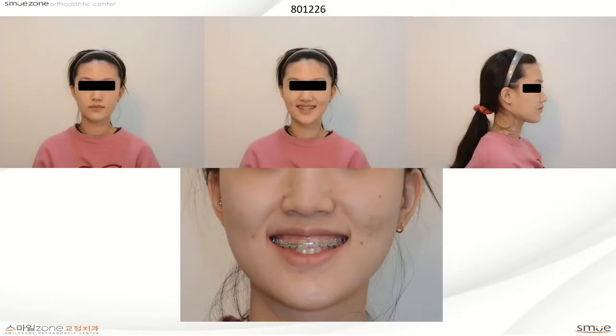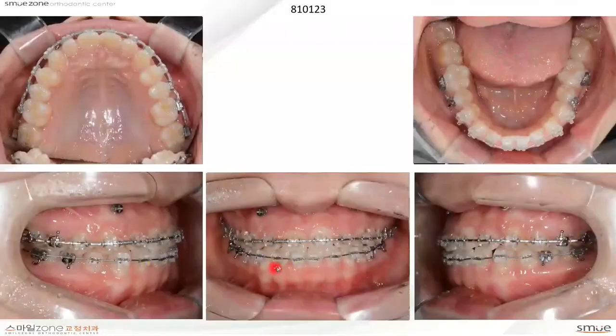Yeah, in this border in the middle. And because of the opening, I can get enough space, enough room to put a bracket on the lower.